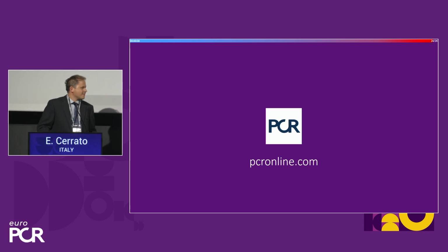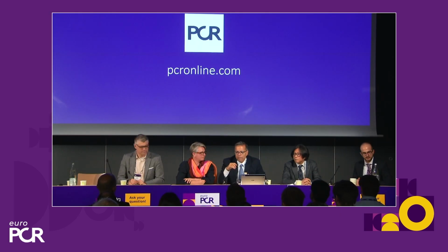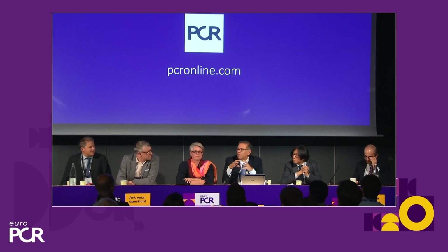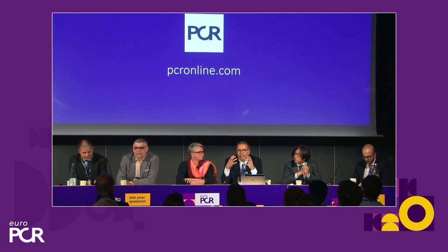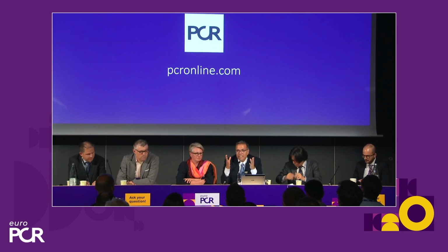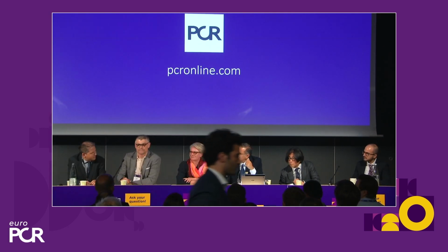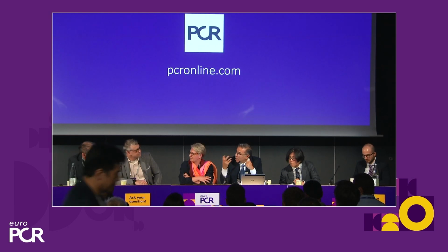Thank you, Enrico. So we'll have very few minutes to have a conversation. The reason why we put this symposium together is because one of the therapies, the technologies that benefit from a very strict and planned protocol for the implantation is the resorbable magnesium scaffold. It is different from the metallic that is more forgiving. So Michael, we need a combination of these imaging technologies to really help us to get there, right?